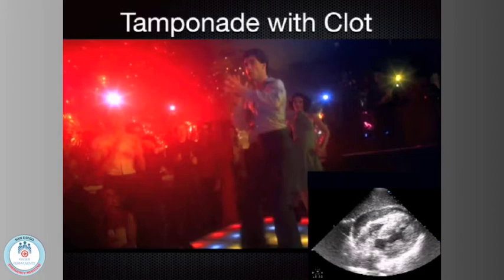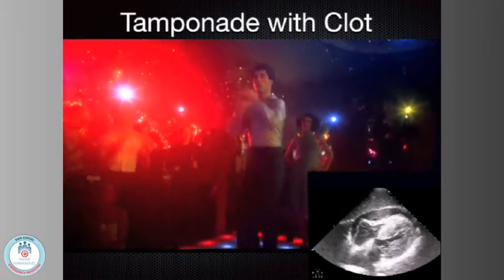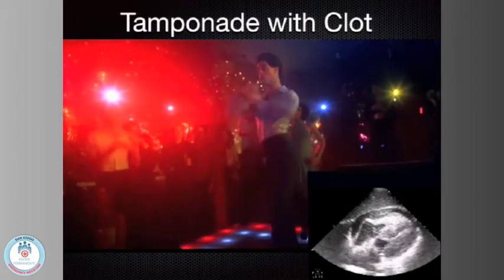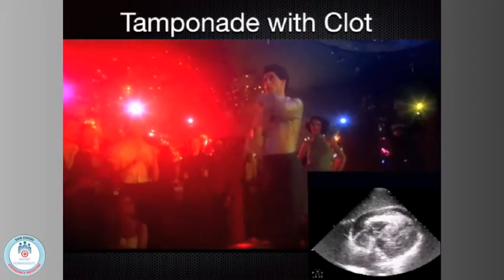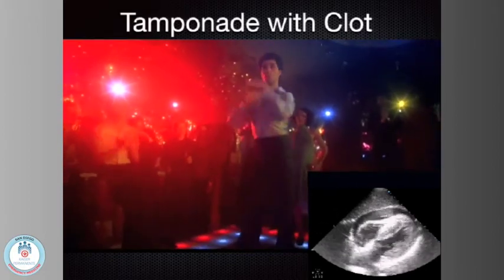So this is tamponade, and there's two ways to know. One is a quantitative way, one is a qualitative way, and that's what I want to show you here. This is the right atrium and the right ventricle. Do you see how they're kind of doing this dance back and forth? There's this kind of thing going back and forth, almost like a teeter-totter. So you can actually see it between the RA and the RV. See, this is the RA free wall and the RV free wall there.